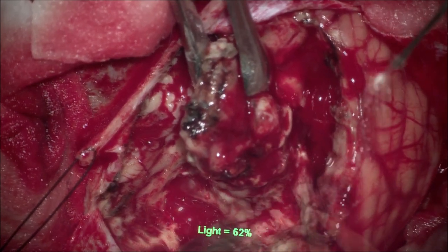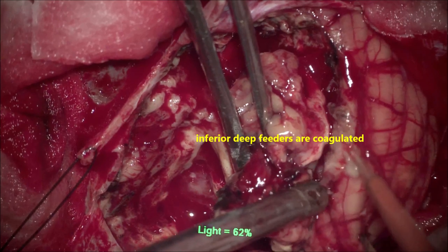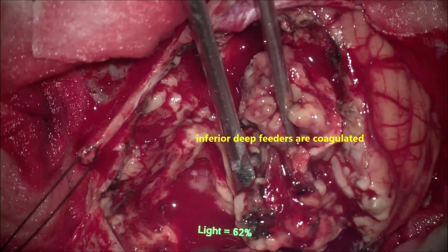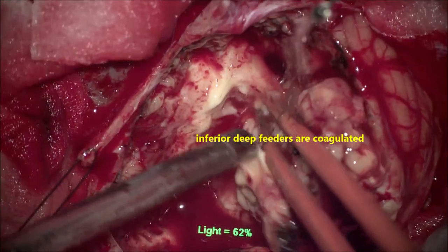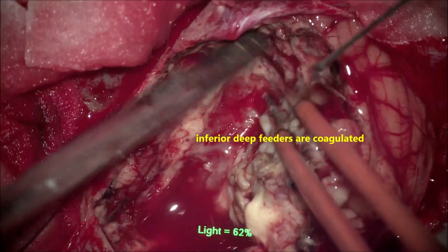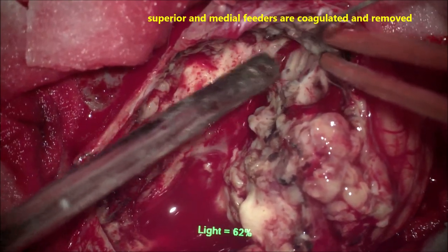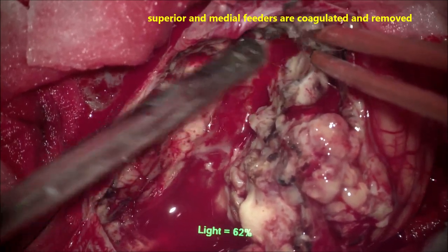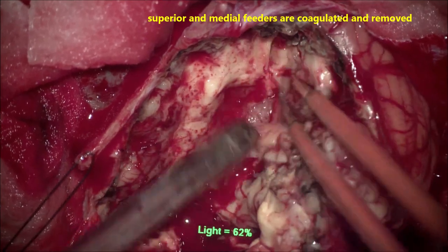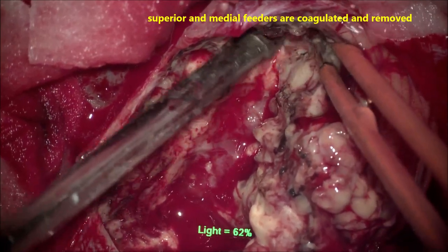From the surface we are going all around — superficial to deep, right to left, and superior to inferior — continually cutting the blood supply to the tumour. There is always a plane of cleavage or gliosis that separates the tumour from the normal cerebellum, and we need to remain in that plane and coagulate the vessels. We are going from lateral to medial and superior to inferior. These are the superior and medial branches coming from the superior cerebellar artery. In spite of coagulation, there is still so much ooze from the periphery — with a lot of patience, these small oozes also need to be coagulated and divided.